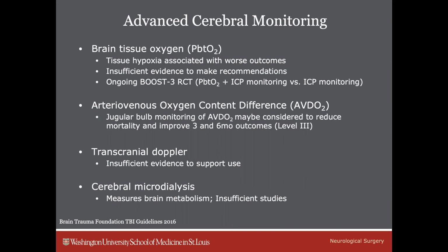There is an ongoing RCT called the BOOST-3, which is actually assessing either using brain tissue oxygen measurement plus ICP versus ICP monitoring alone. So I did a cerebrovascular skull-based fellowship at Seattle last year, and they were part of the BOOST-3 trials, so patients would get randomized into that group.